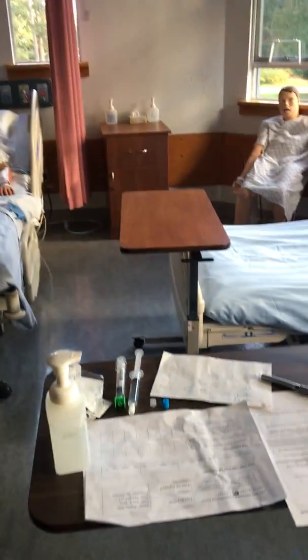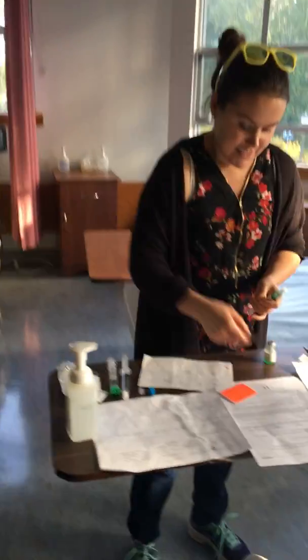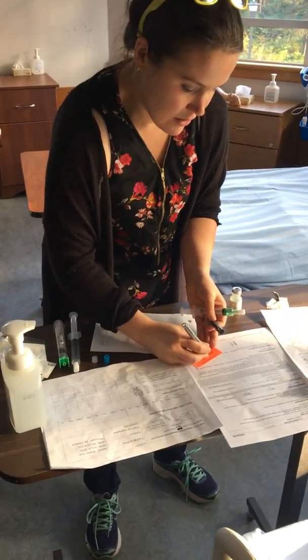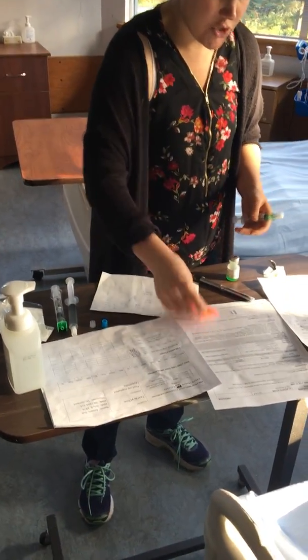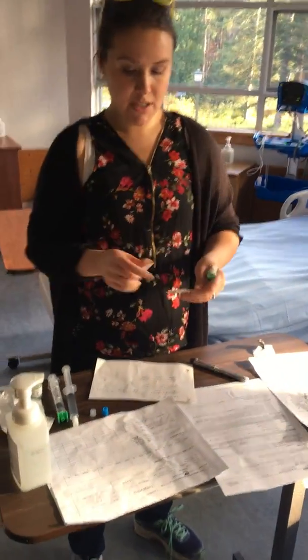Oh, before I put this down, I need to put a medication label on it. So I'm going over here, grabbing a medication label. I'm going to write on it what it is. Narcan. And now that I have this in my syringe, I'm going to put this back in my Omnicell or wherever it has to go, and do my third check of my medication.